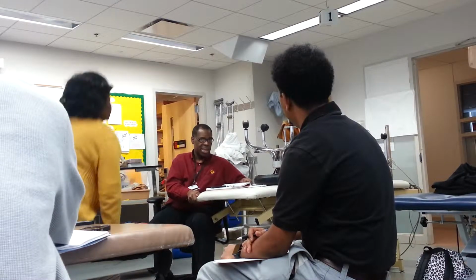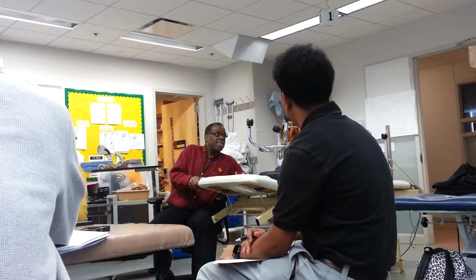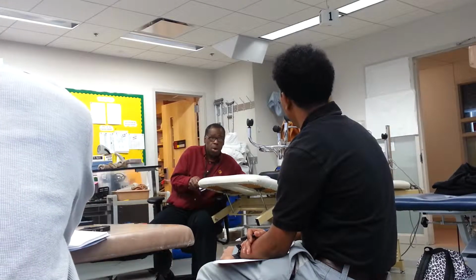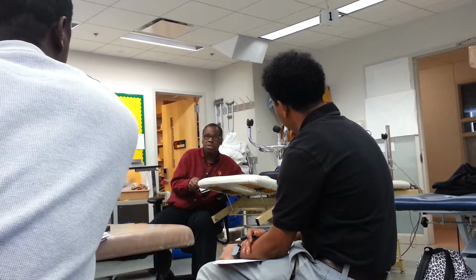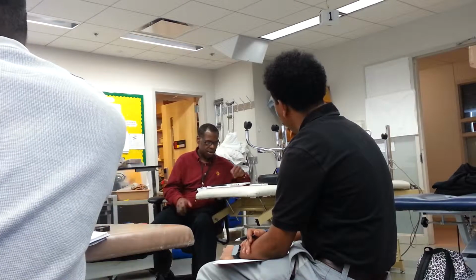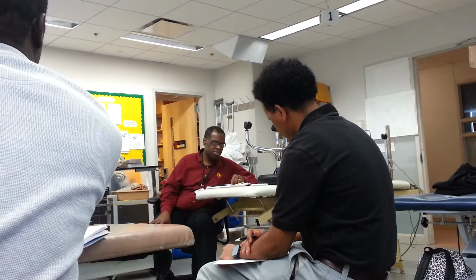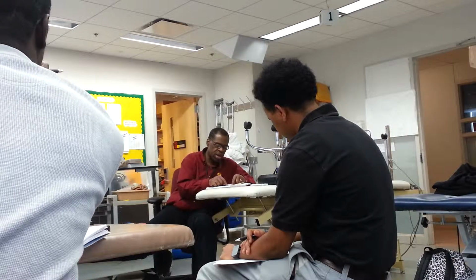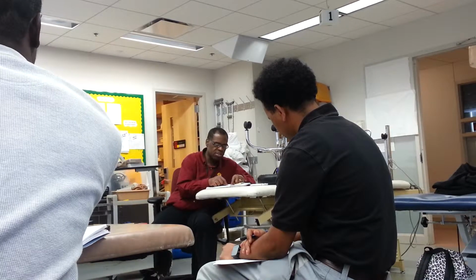That's a twitch, pulse rate. If I keep doing this, now I'm getting, because I'm in the second column, I'm in motor, because I turned it up to 50. If I turn it up to 100, it's still moving, but the muscle is going to get tired fast. Okay. All right, so muscle spasm, muscle weakness, re-education, pretty much some of the same parameters. However, let's go with muscle spasm motor protocol versus muscle weakness or re-education motor protocol.